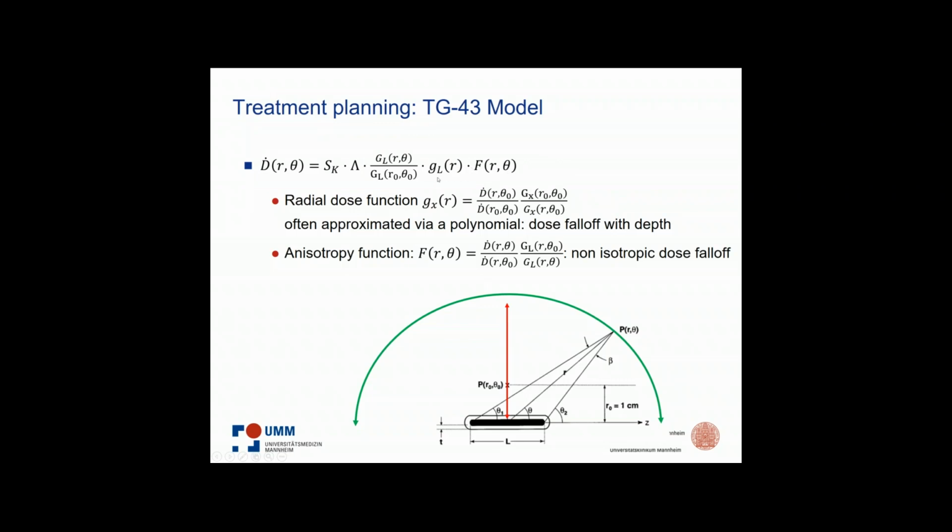And here this describes the absorption, because you have the spectrum, and according to the spectrum you might have different absorption characteristics. So it describes, over the measurements, how the dose drops over the distance, ignoring the geometry and the source part.